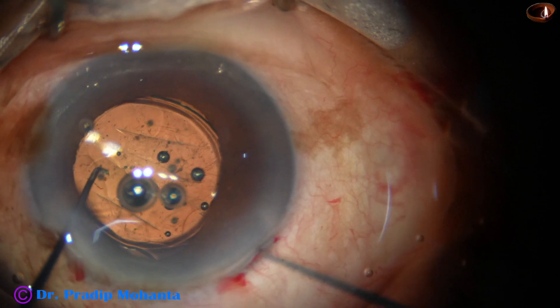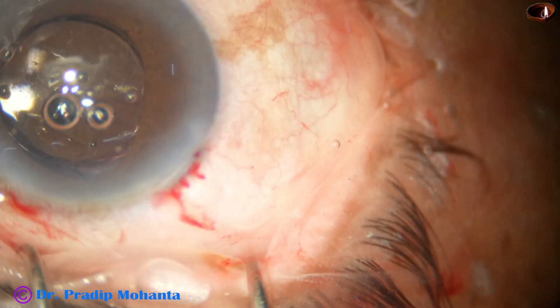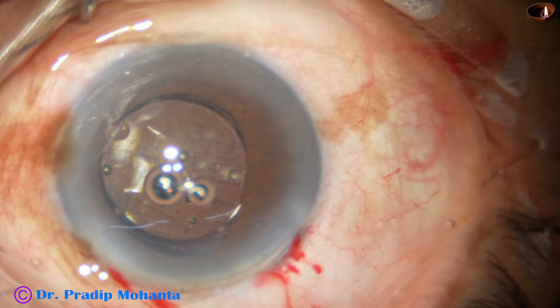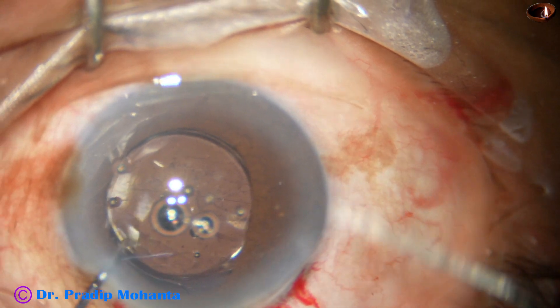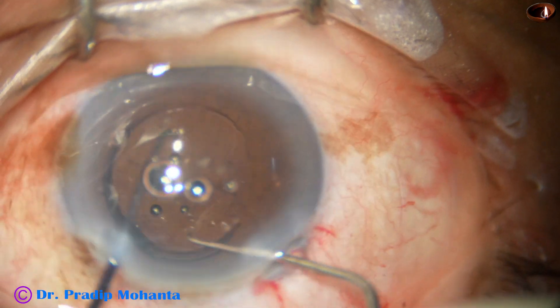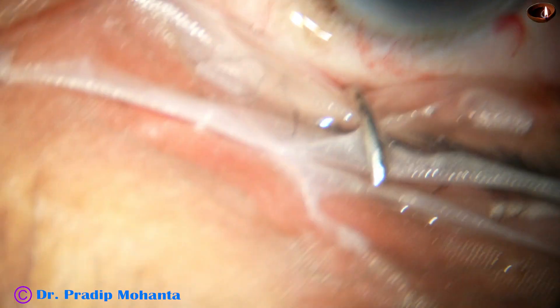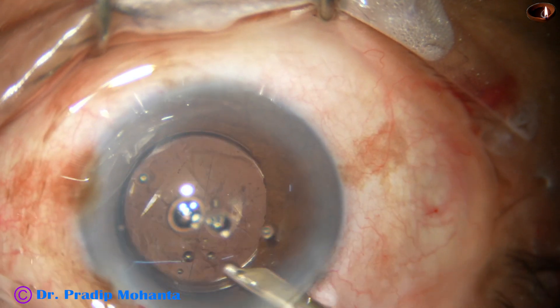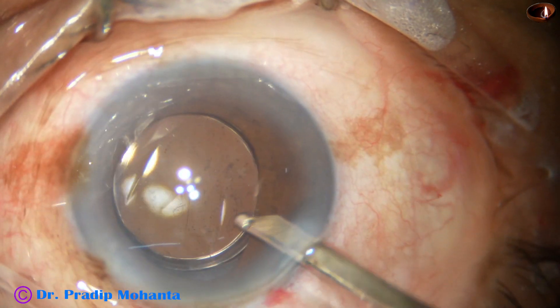Place the lens haptics nicely in the capsular bag. The trailing haptic is not yet in the capsular bag and I am using a hook to place it in the bag and dialing the lens to orient the intraocular lens nicely. Two hooks are used because the zonule is weak — bimanual rotation is always safer in eyes with weak zonules.